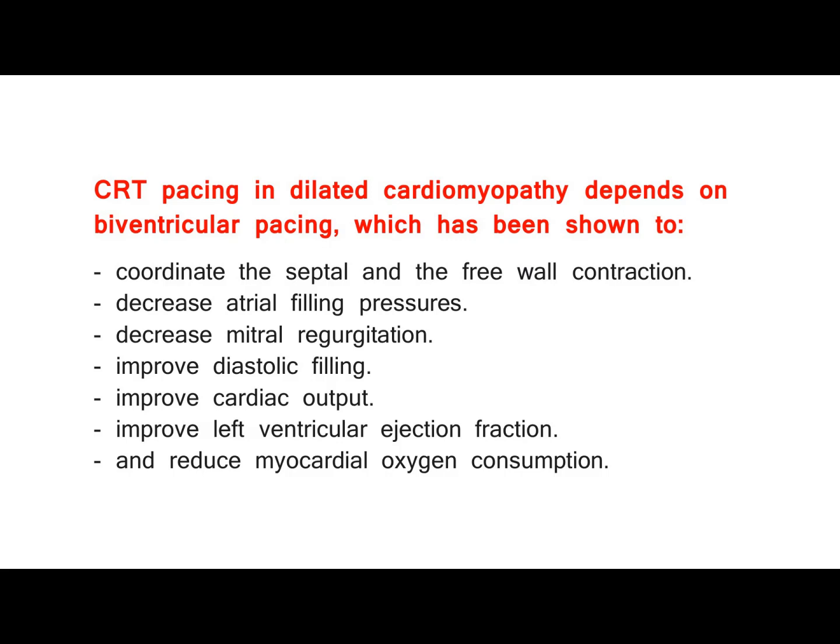Decrease atrial filling pressures. Decrease mitral regurgitation. Improve diastolic filling. Improve cardiac output. Improve left ventricular ejection fraction. And reduce myocardial oxygen consumption.